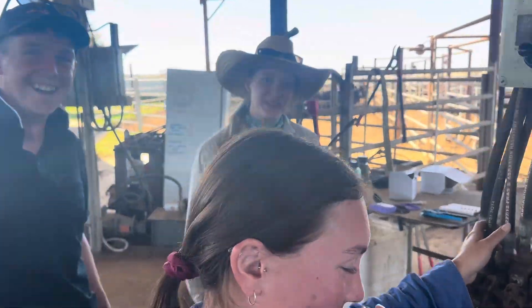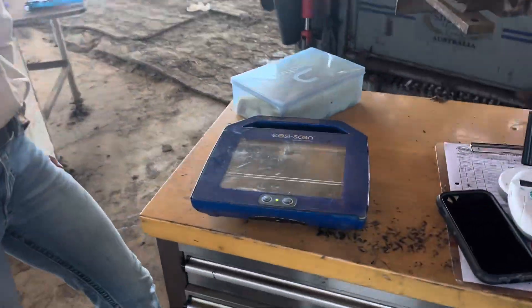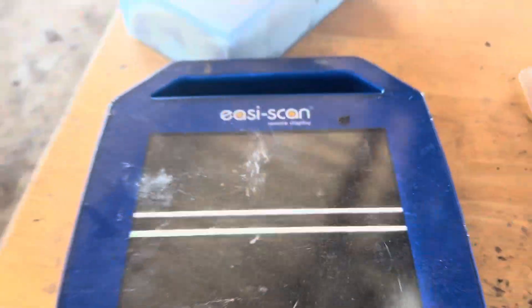Hi Emily, it is now your time. You have to tell us how far along they are. Here's the screen. Yeah, you can do that. Holly's really good at running this.